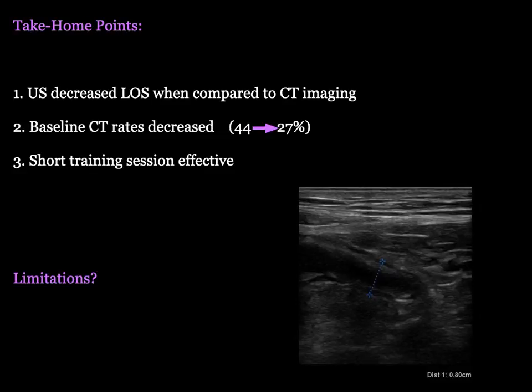And the short 30-minute training session was actually really effective. So residents were able to diagnose appendicitis after a short training module performed with an attending physician who was ultrasound fellowship trained. So certainly there were a couple of limitations to the study, which you can probably imagine.